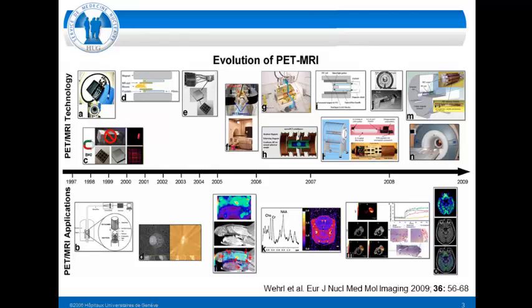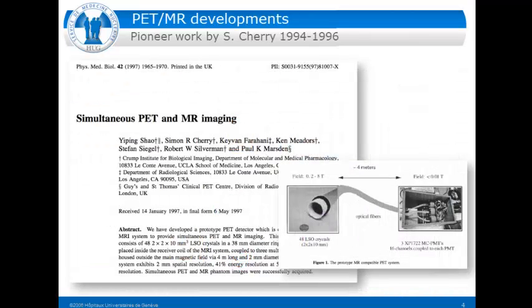It was a little bit different, and when we look at the timeline, the development also began rather early in 1997, with, let's say, similar development of technology in small animals, and also already in some clinical and preclinical applications. So how did it start? The first publication on it was in 1997, about the principle, from physicists who developed an imaging system still based on photomultipliers. And the problem in MR, everybody of us knows, is that photomultipliers in a magnetic field don't work.